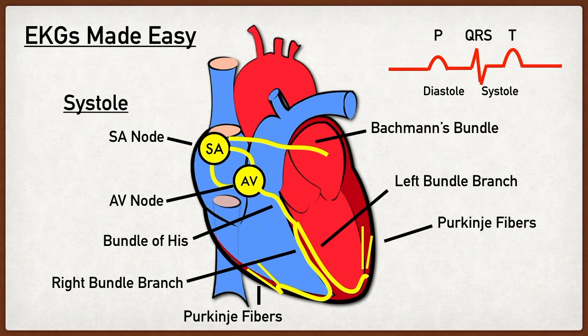I do want to point out that you'll notice there was no specific wave that represented atrial repolarization, and that's because that occurs during ventricular depolarization, so it's tucked away and hidden in that QRS complex.